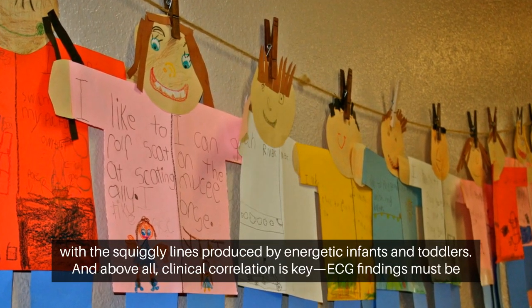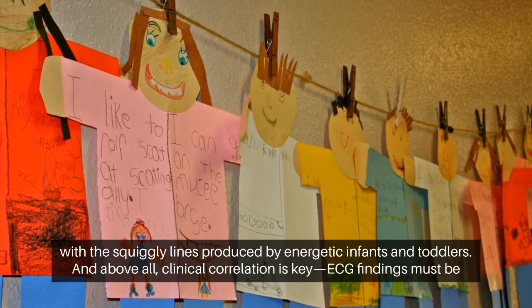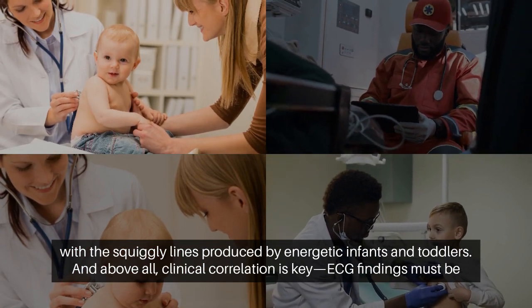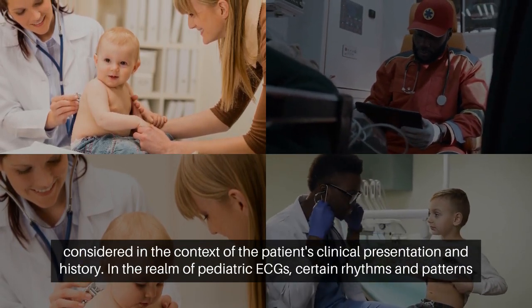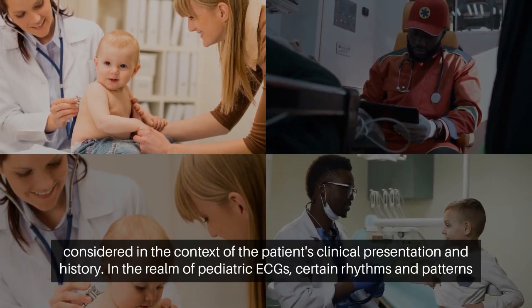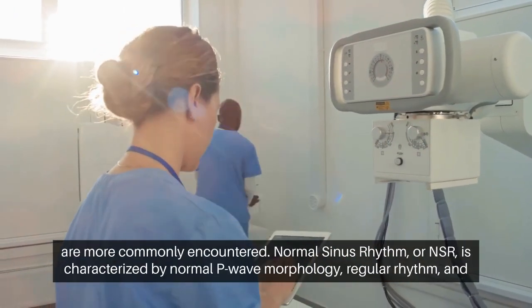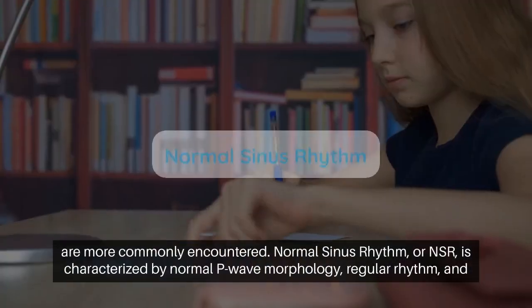especially in irregular rhythms. Differentiating normal age-related changes from artifacts is a skill particularly useful when dealing with the squiggly lines produced by energetic infants and toddlers. And above all, clinical correlation is key. ECG findings must be considered in the context of the patient's clinical presentation and history.